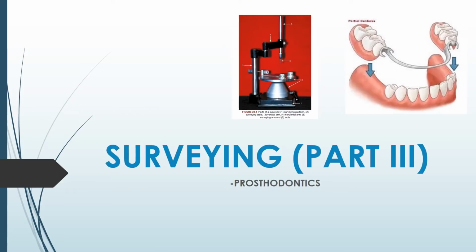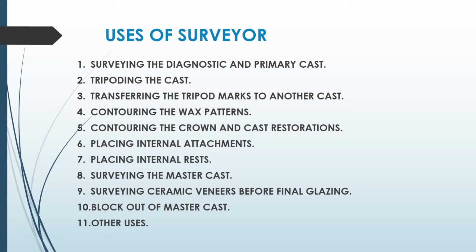Moving on towards the last part of surveying, that is the uses of the surveyor, that is part 3 of surveying. So these are the uses of the surveyor. These are the 11 uses. The first is surveying the diagnostic and primary cast.